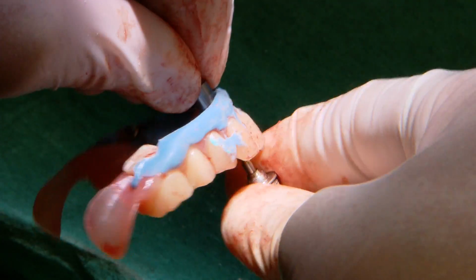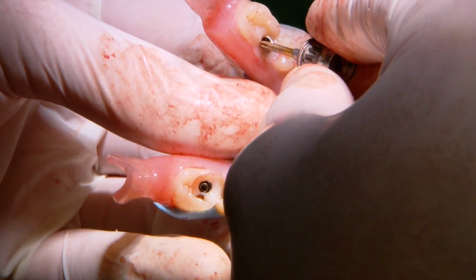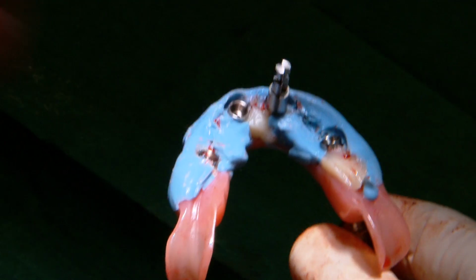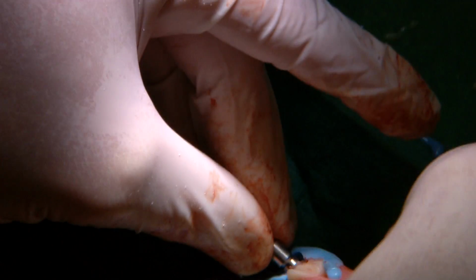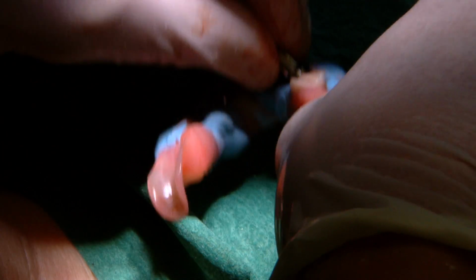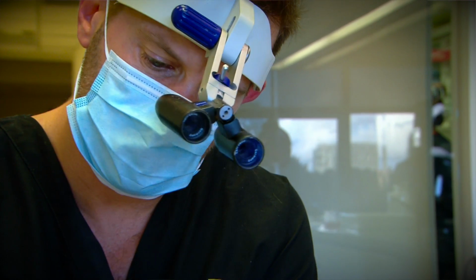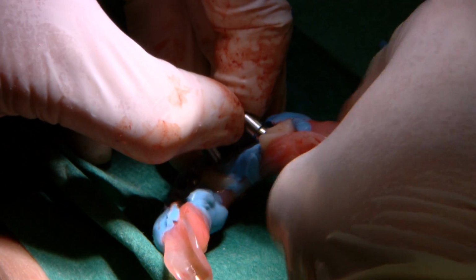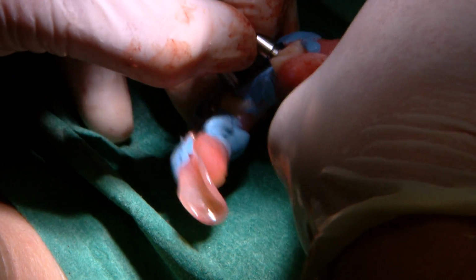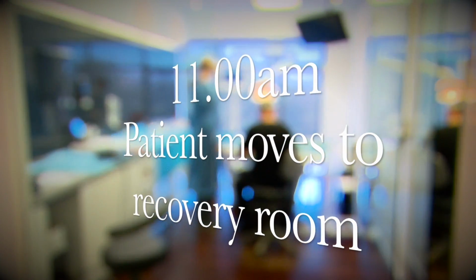What we're doing now is just attaching pretend implants to our bridge, so the technician can pour a model up. It'll be an exact replica of what's inside Lynn's mouth at the moment. He'll have impressions of the gums and tissues, he'll have the teeth in position, the bite, and obviously the abutments, which are on top of the implants. He'll have exactly what shape they're in. And that goes off to the technician.